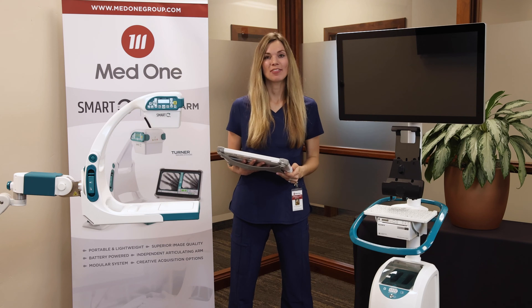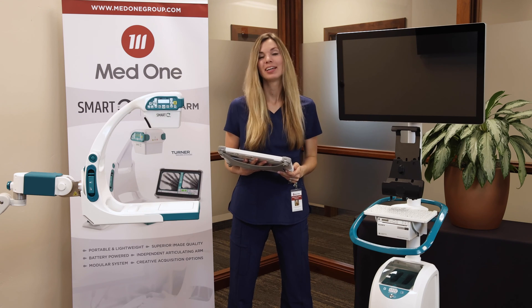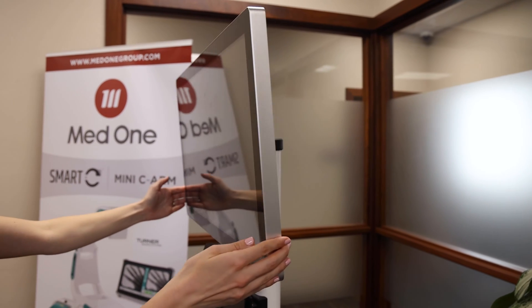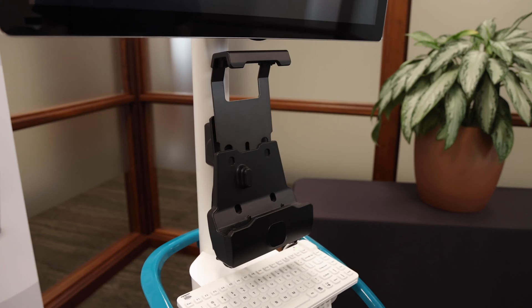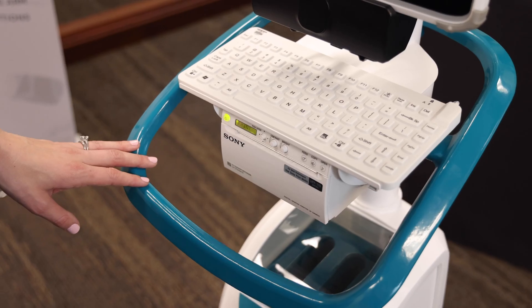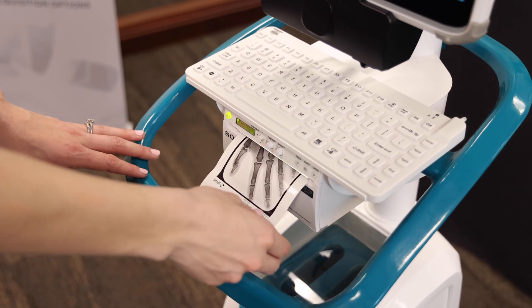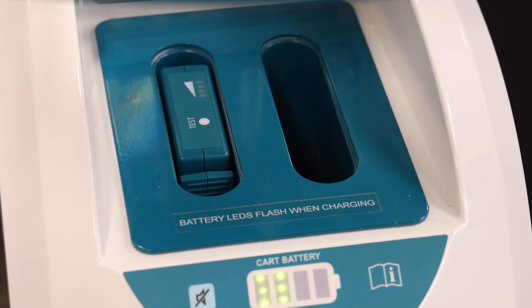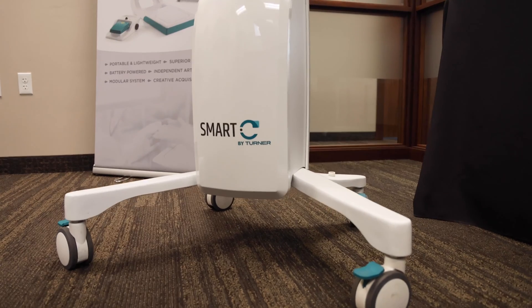Next, we have the optional monitor cart. The monitor cart has an internal battery, or it can be plugged into an outlet. It has a 27-inch touchscreen monitor that can be turned or tilted for better viewing. It has a tablet docking station, waterproof keyboard, medical-grade printer, and a place to store and charge your Smart-C batteries, and wheels that lock into place.